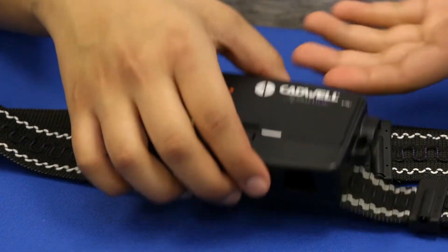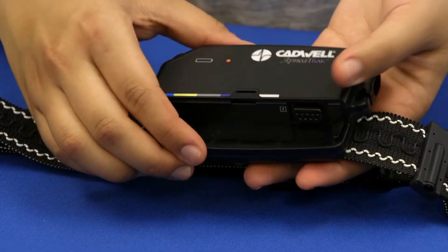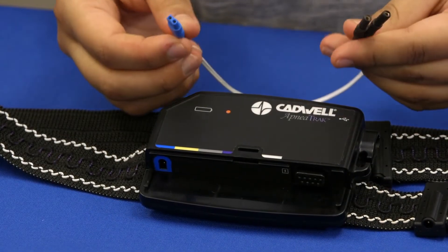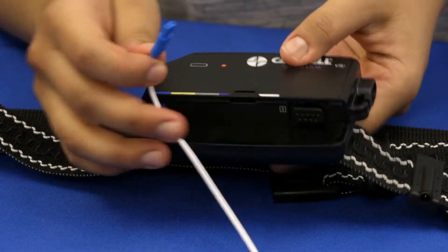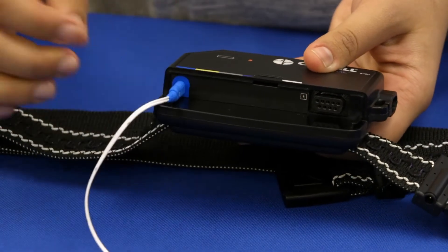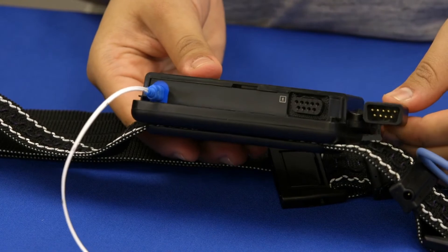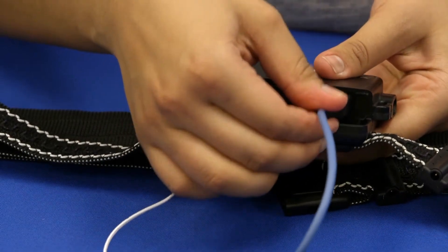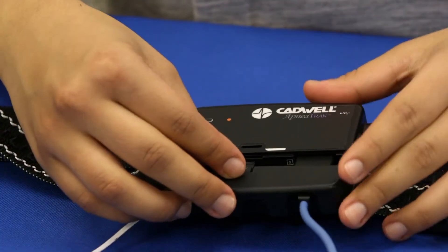To remove the port cover, press on the arrow and slide the panel down. The sensors are color coded to match the connection ports on the apnea track. Connect the blue input from the chest belt cable into the blue port. Plug the black connector from the finger oximeter sensor into the black port. Then replace the port cover.